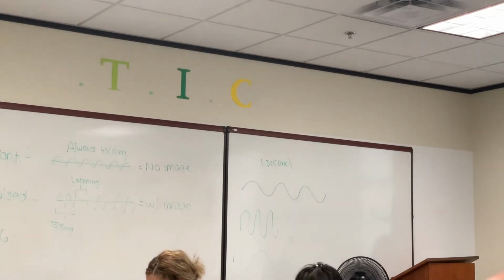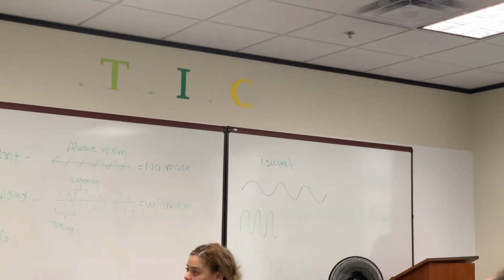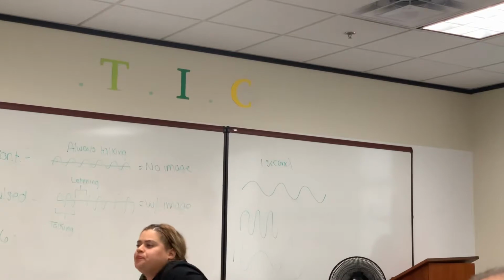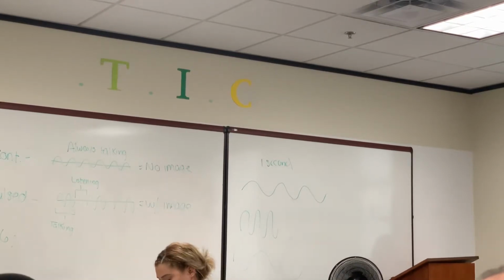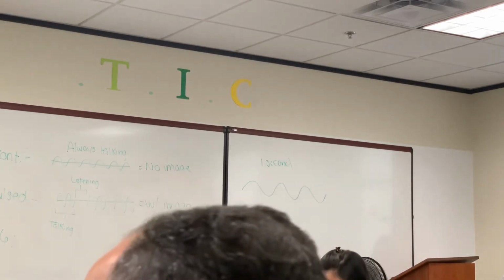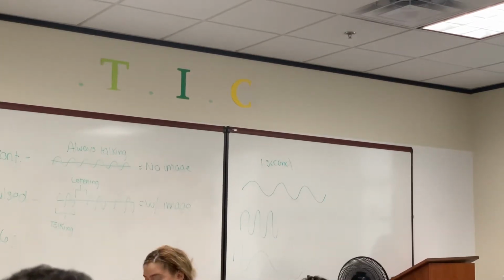If I have a high frequency transducer, number 2, then look how short my pulse duration is. That's why they're inversely related. And you already know how it's related to period, so automatically it's going to be inversely related to the frequency. That's why I say, guys, building blocks, because you have to know this to know that. You have to know the beginning to know where we're going.